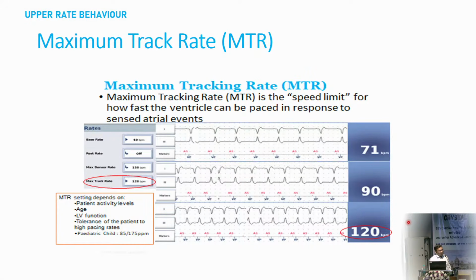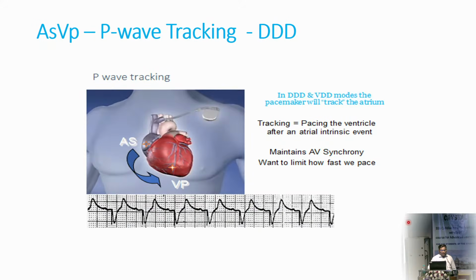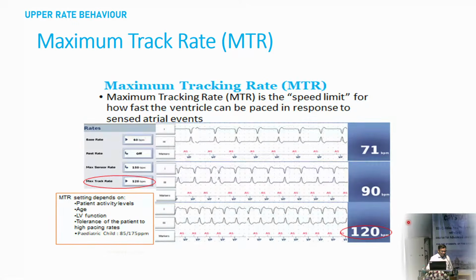So basically, as I mentioned, look at this QRS. As I told you, right ventricular pacing produces a left bundle branch block. And if you are pacing at 150, 160, 180, or higher than that, it is not safe again. We are basically creating a VT. Though there is AV synchrony, it is a faster rate, so the patient may feel palpitation. It will be symptomatic.